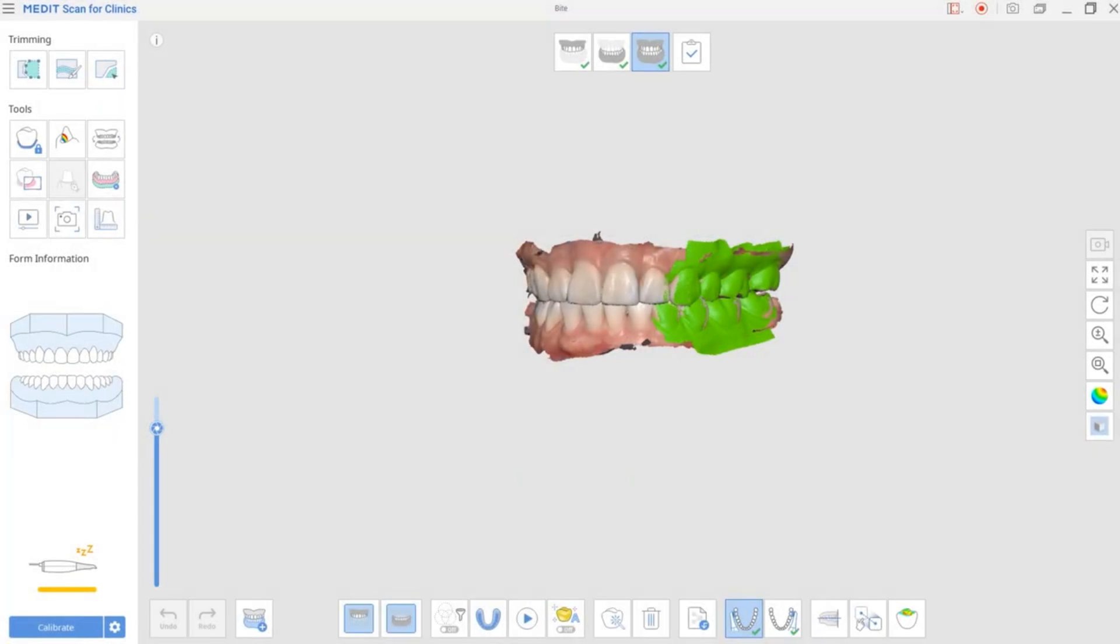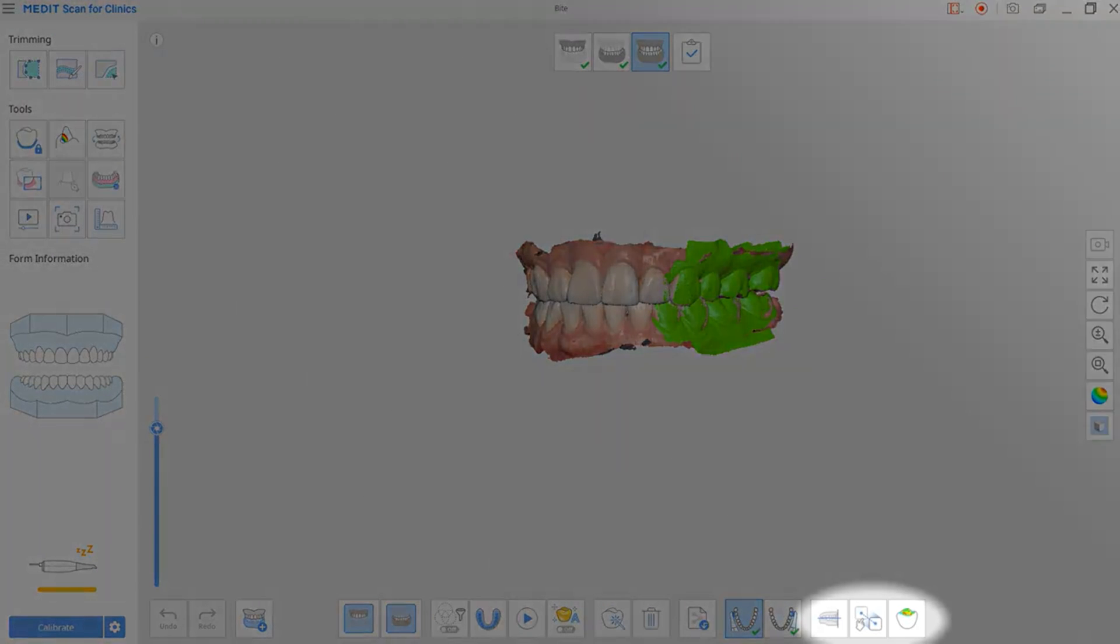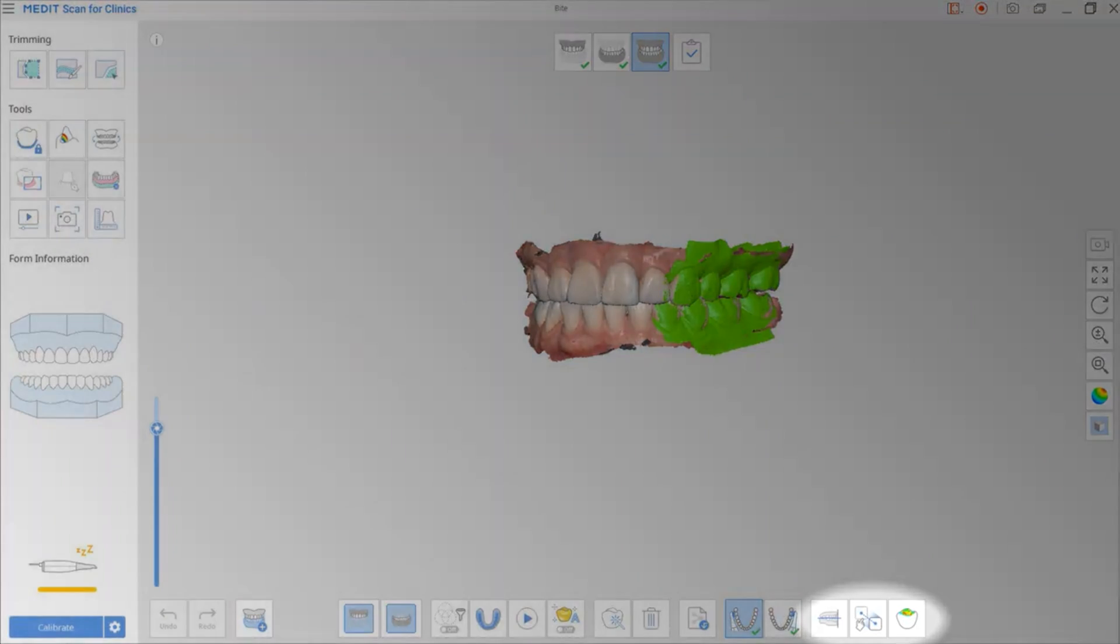There are various functions for the occlusion in MeditScan for clinics. In this video, we'll be going over those functions.